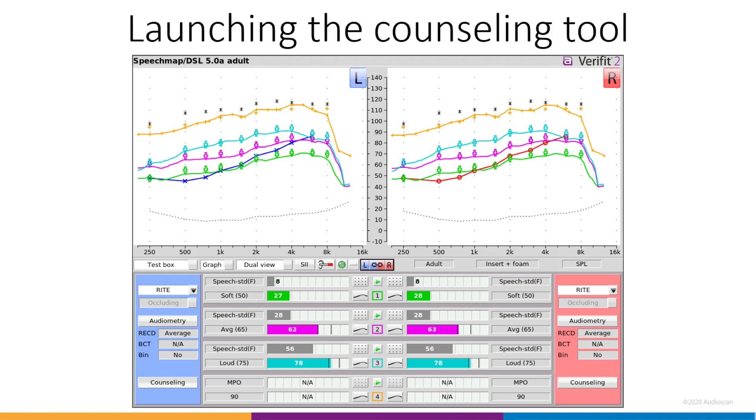Our starting point is here in SpeechMap, where we've already run a set of aided speech tests at soft, average, and loud levels, as well as MPO. To launch the counseling tool, click one of the counseling buttons in the lower left or right corners.